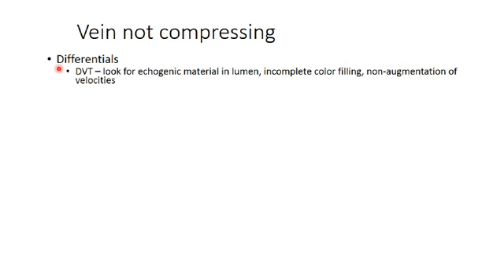Sometimes when you have a non-occlusive critical occlusion, you may actually have an increase of flow velocities at that particular site. Okay, so be mindful of that. That could be one of the supporting features for you.